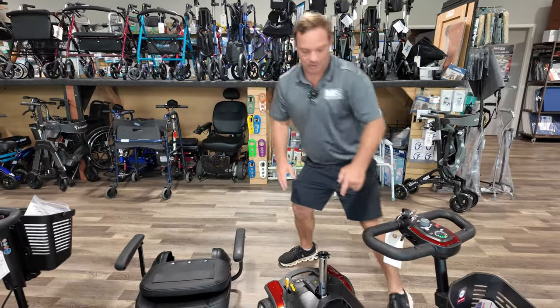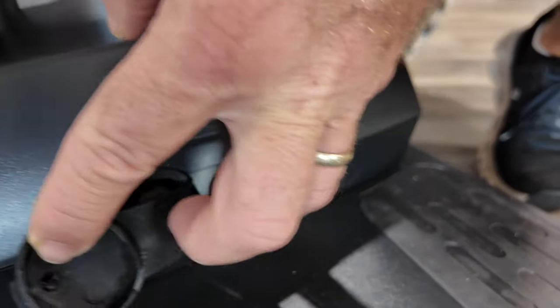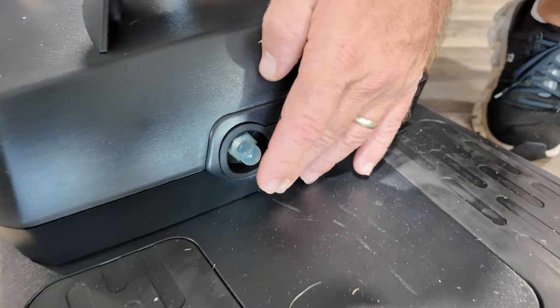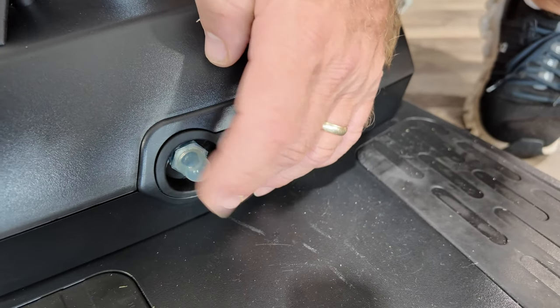To charge this unit, you charge it directly to the battery pack. There's no charging port on the tiller — it's right through this battery pack. Your charger plugs right into that and it comes with the charger. This is also a circuit breaker. If something trips and the scooter's not turning on, it could just be that.